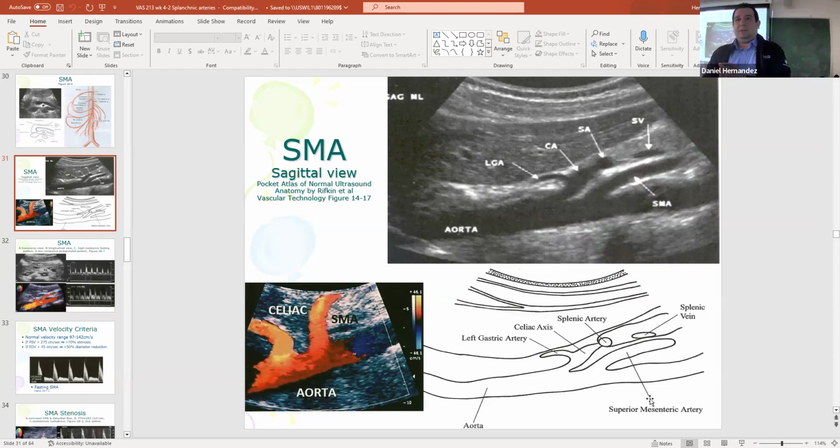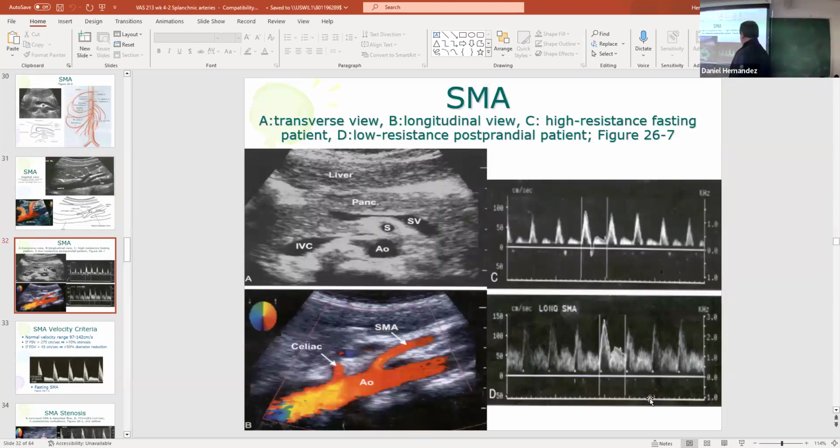Okay, I guess I'm just confusing it because I thought low resistance was good. For this one, it's good if they've just eaten. So they could just be lying to us, saying yeah, I'm fasting. Check their gallbladder. Yes, you guys could check their gallbladder, if they have one.